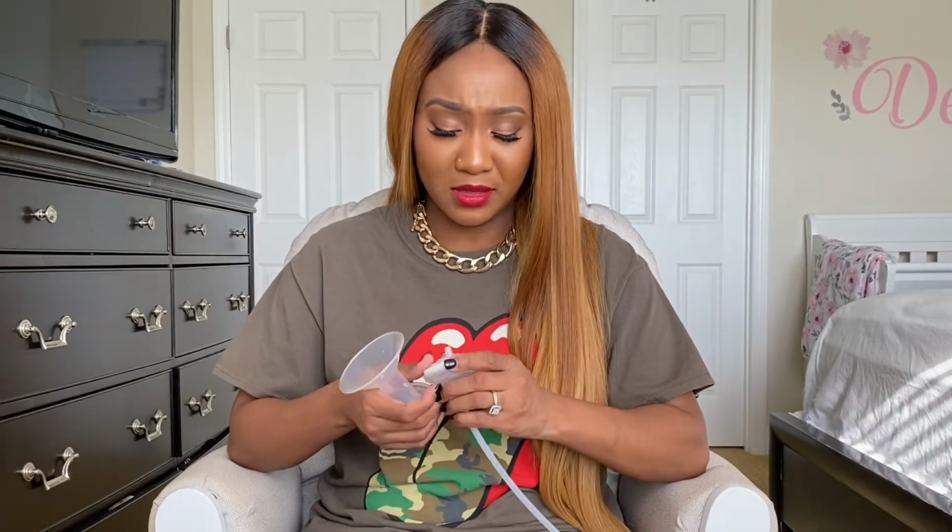Make sure you wash everything after you're done using it. Every time you're done using it, be sure to take this off, because sometimes milk does get into this little part, and that was a mistake I made. I always washed this with the bottles, but I never washed this little thing. After a week of using it, one day I took it apart and I was like, oh my God, I had to replace it because it was so stank.